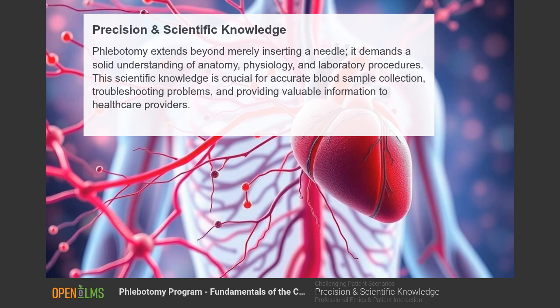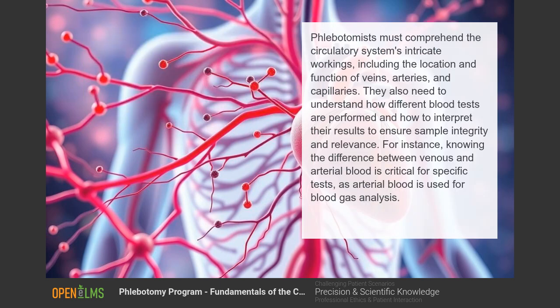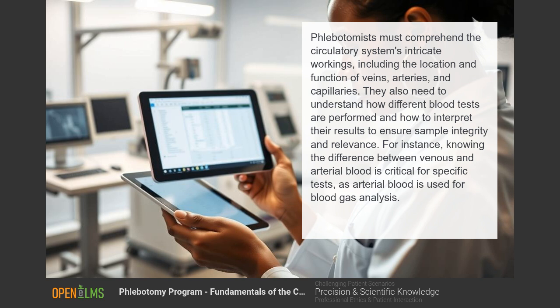Precision and scientific knowledge. Phlebotomy extends beyond merely inserting a needle. It demands a solid understanding of anatomy, physiology, and laboratory procedures. This scientific knowledge is crucial for accurate results. Phlebotomists must comprehend the circulatory system's intricate workings, including the location and function of veins, arteries, and capillaries.